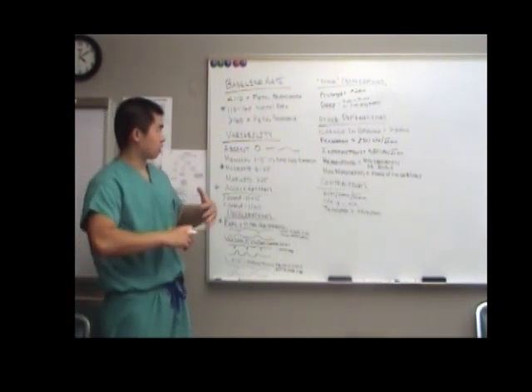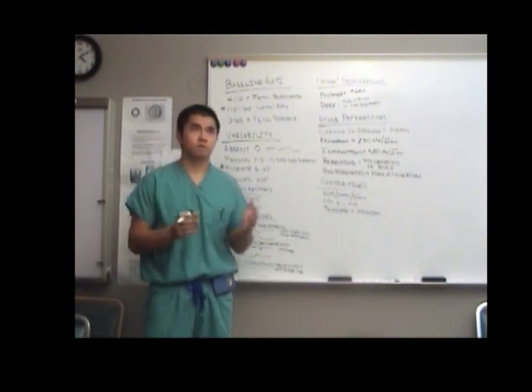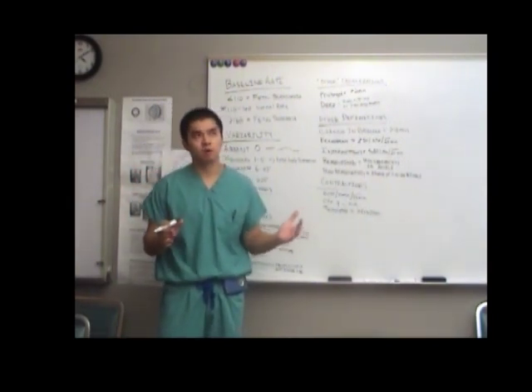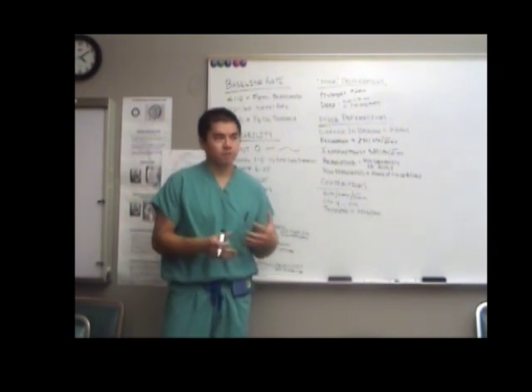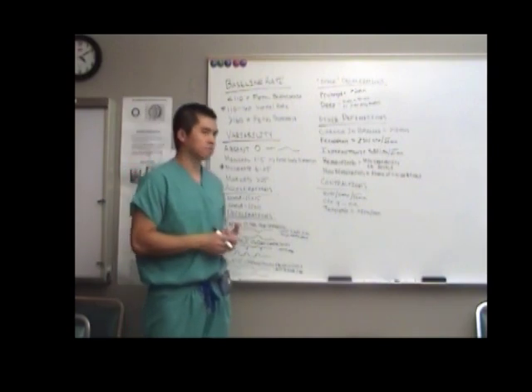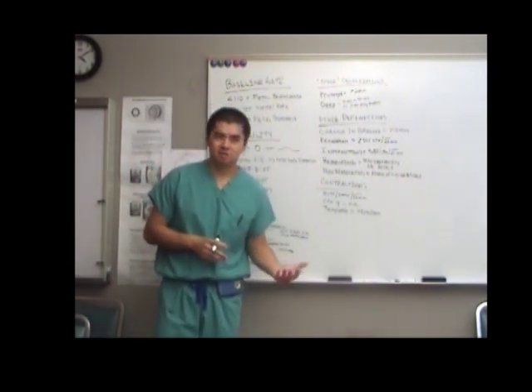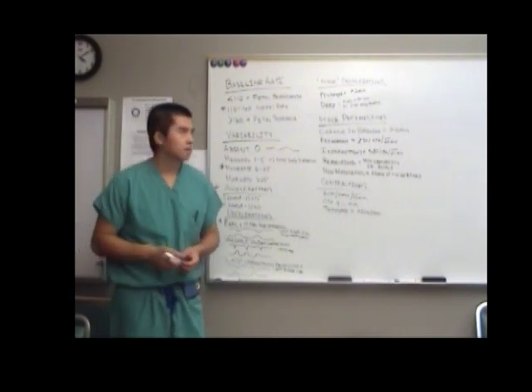If you say there's a prolonged deep decel, well, prolonged could be anywhere from 2 to 10 minutes. Is it 2.5 minutes? Is it 8 minutes? If you don't describe it exactly, then it's hard to say. If you say it's a deep decel, is it deep down to 100 or deep down to 60? Because I'm a little bit more worried if it's down to 60.